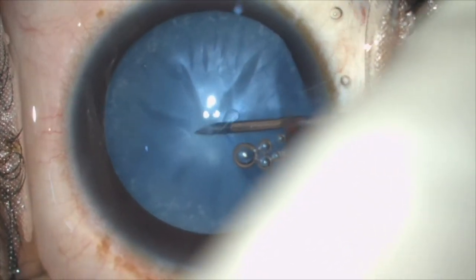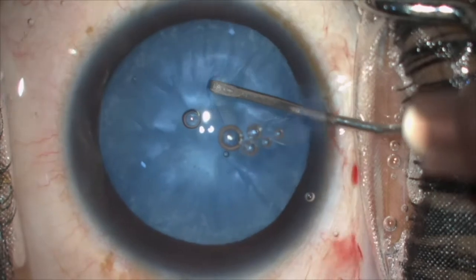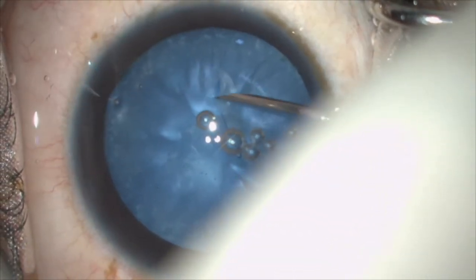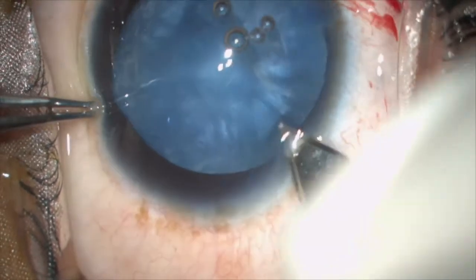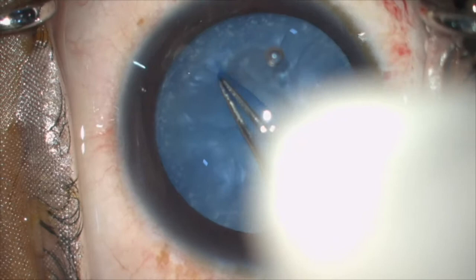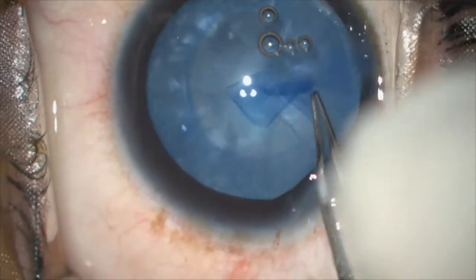In some intumescent cataracts where the nucleus is very soft, even after aspirating centrally you will not be able to continue with the rhexis because of loss of counter traction. So you take the needle, aspirate around the periphery, and then after making a clear corneal entry using a forceps, you continue the rhexis — always making sure you hold close to the margin of the point of tear.